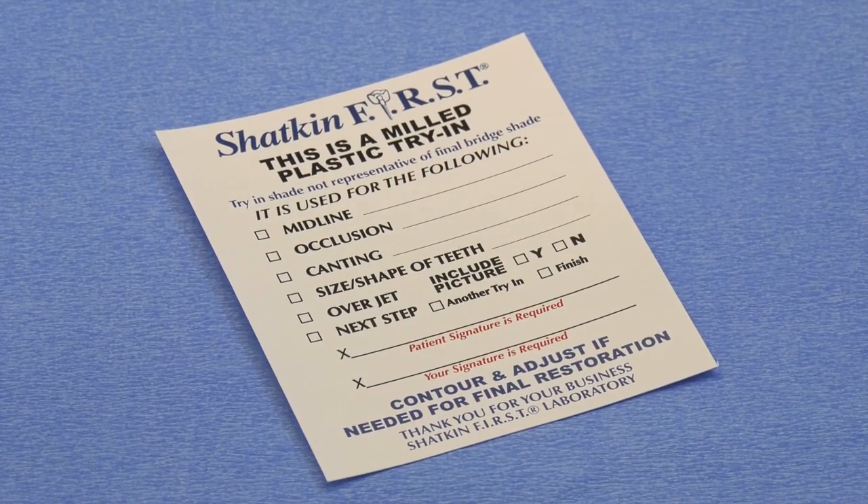When doing your try-in, make sure you refer to the slip and fill it out properly. If you want a second try-in, we'll do a second try-in. Once you're comfortable with the final try-in, communicate all changes to our lab techs. A picture is worth a thousand words — take photos of the try-in, take a shade guide, put it next to the patient's face, and select the proper shade. This includes not just the porcelain color of the teeth but also the gingival color. Have a gingival porcelain shade guide as well.